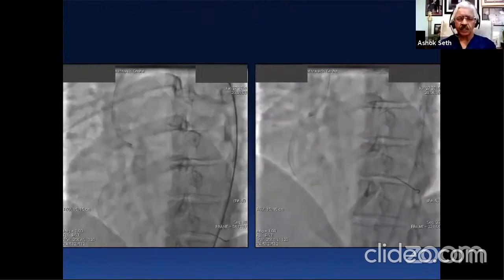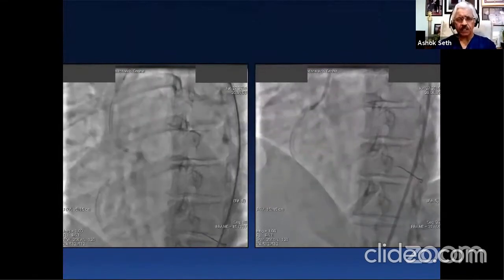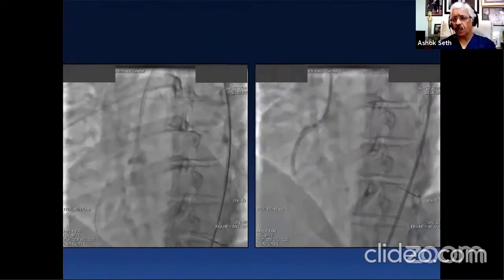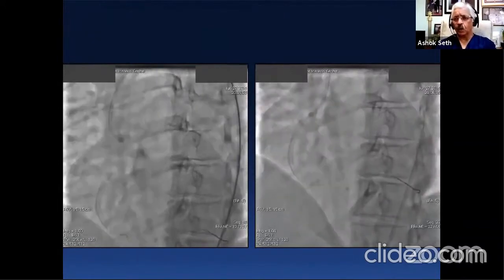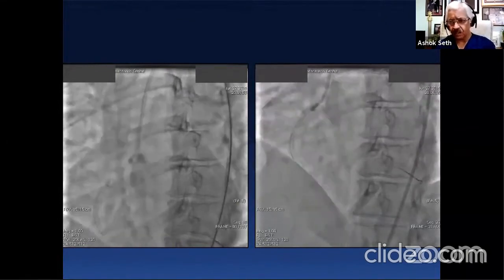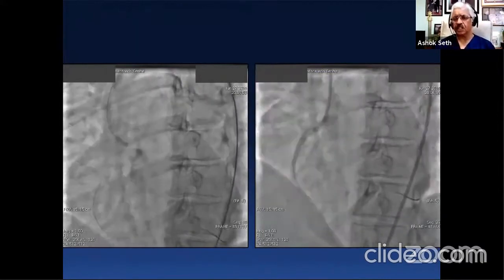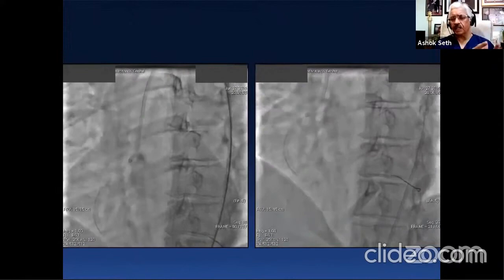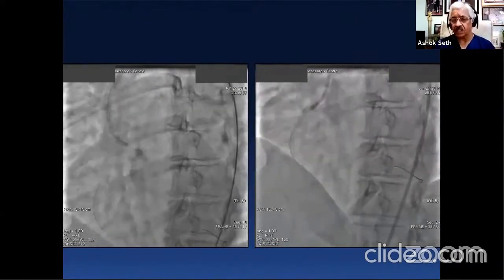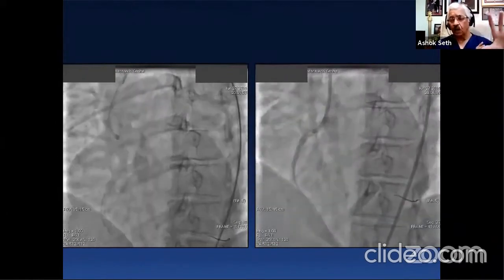So there's certainly a role for a lot of assessments, but a lot of assessments can be done non-invasively. But IVUS, by the way, looking at the slit-like orifice, looking at the compression via IVUS has a major role. FFRs and iFRs haven't been recommended or tested in these circumstances, because we relied on CT, exercise nuclear scans, and IVUS as a 2B. By the way, the rest are a 1A.